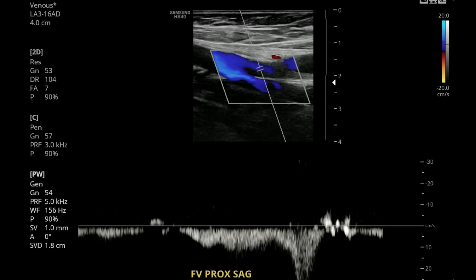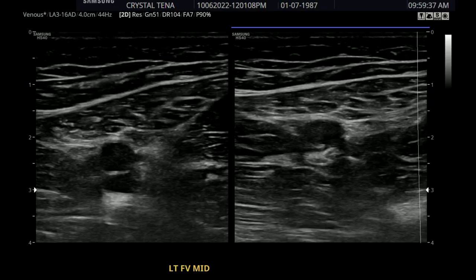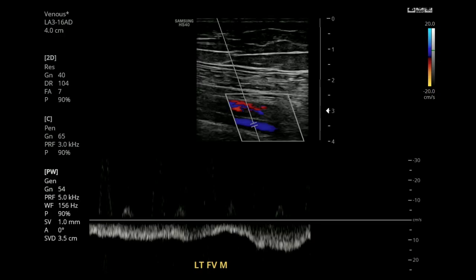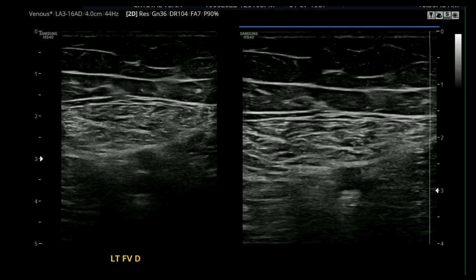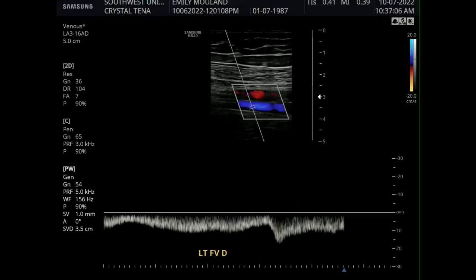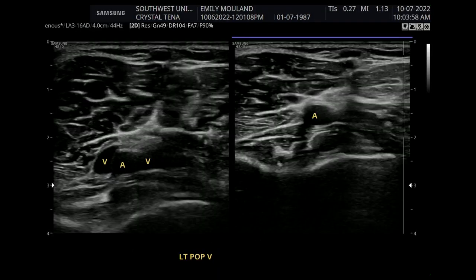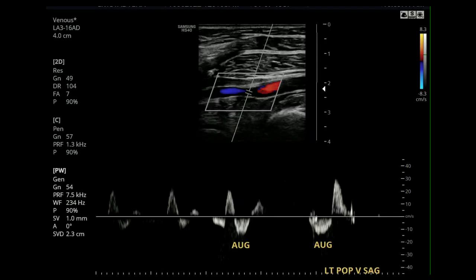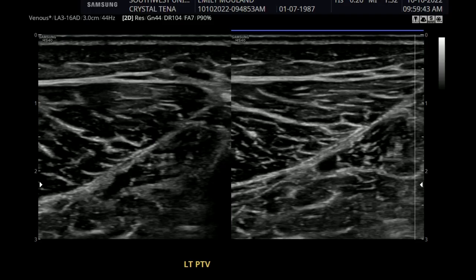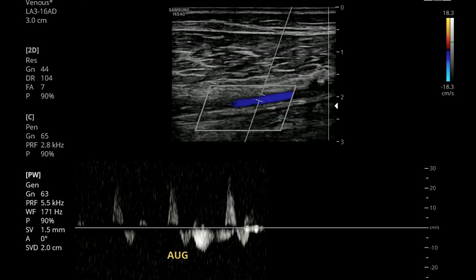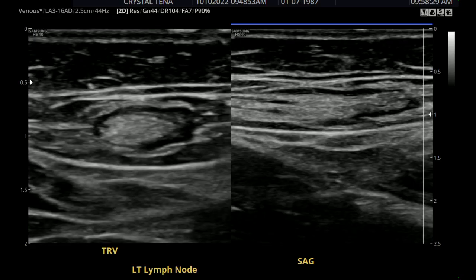Either way, everything is going to stay exactly the same — you still need dual screen, you still need color, and you still need the waveform with augmentations. Remember, this study is to look for any blood clots that may be happening in the patient's leg. We don't want those blood clots to dislodge while we do the augmentations, so before we do any of that, we need to make sure that we're compressing from the common femoral vein all the way down to the femoral vein distal. Once we get to the popliteal vein behind the knee, you're also going to do compressions there to double-check that there are no clots that can dislodge.